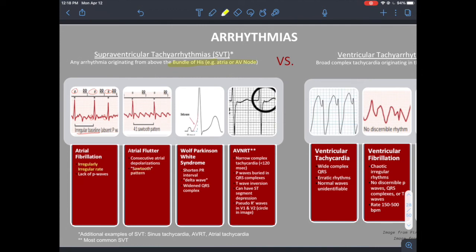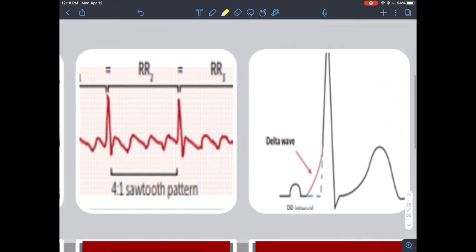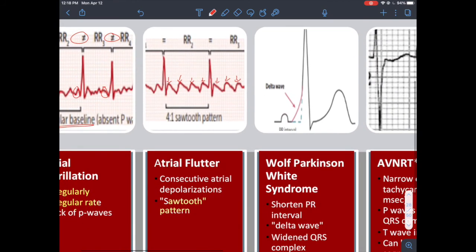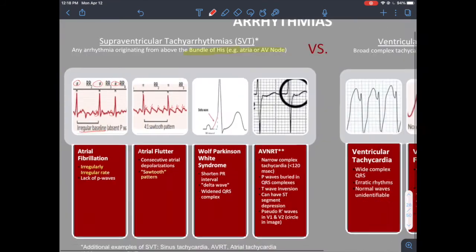Atrial flutter: the buzzword is sawtooth pattern. You have a normal RR interval to differentiate it from AFib, but multiple P waves with a strange morphology — from frequent atrial depolarization, some of which are not followed by ventricular depolarization. That sawtooth pattern is how you distinguish atrial flutter.